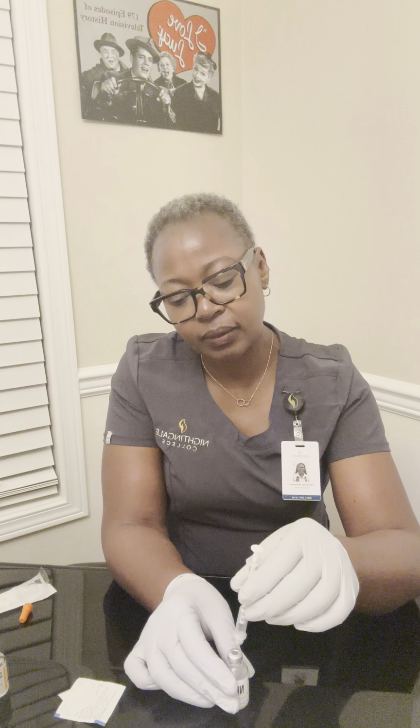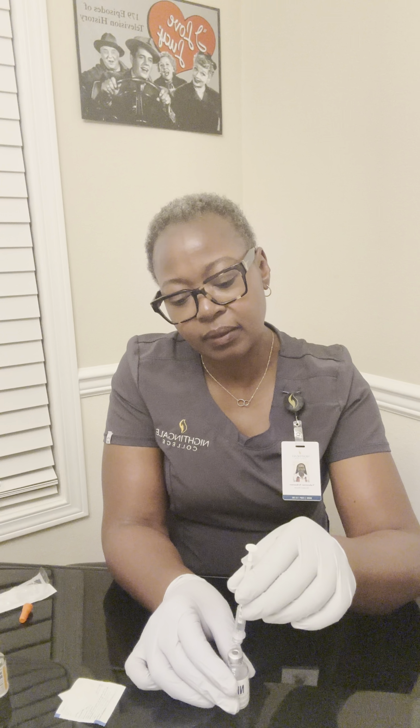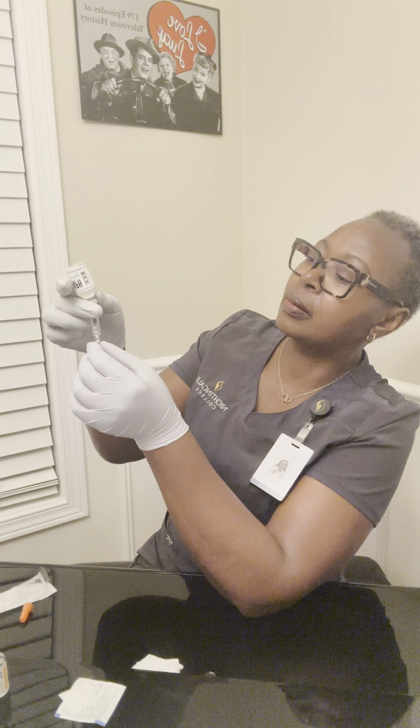intermediate acting. So in that case, I'll mark where my 12 mark goes to, because I will not be able to return the insulin back to the vial after I withdraw whatever amount. So I need 12 units, and I need to be very specific on this.